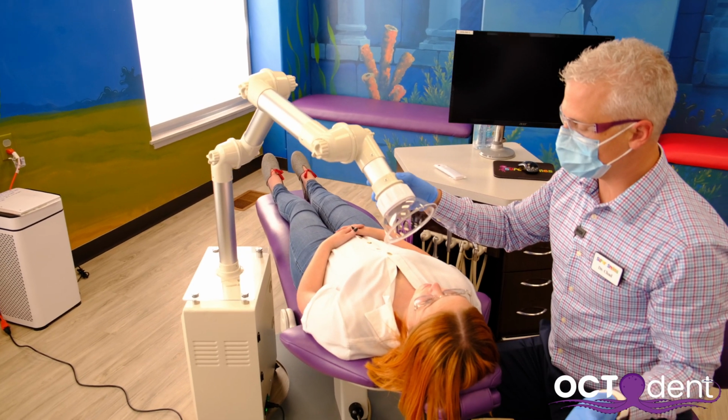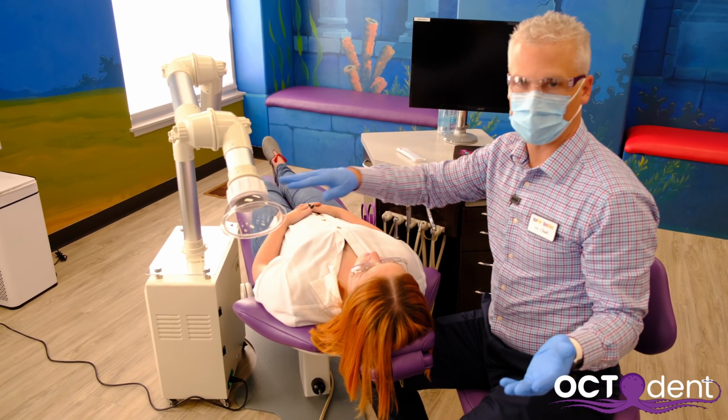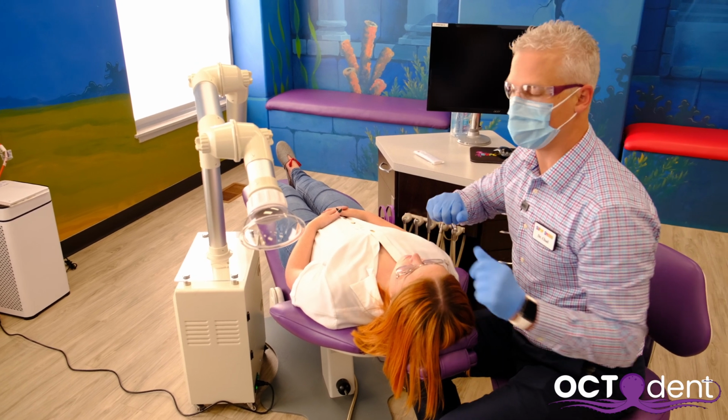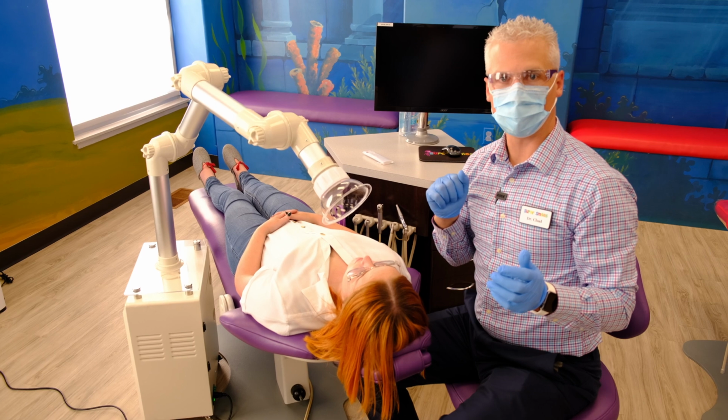When I'm done with the procedure or I'm not using the aerosol suction, I'll just merely go like that. Okay, I'll push this out of the way, and I'll do what I need to do. But while I'm using aerosols, I'll just move it right back into position.